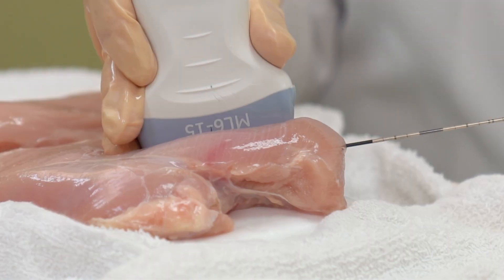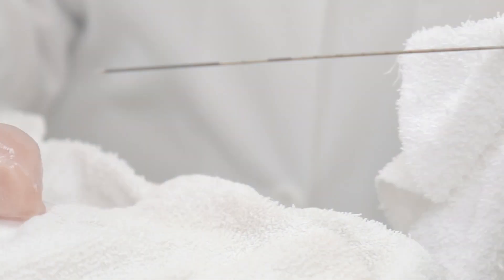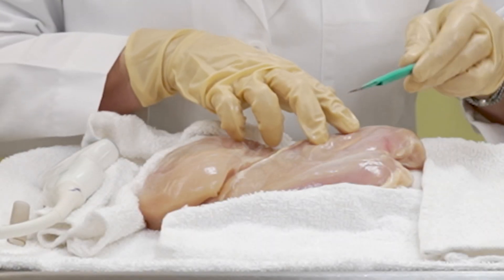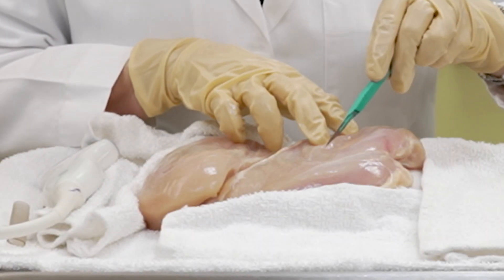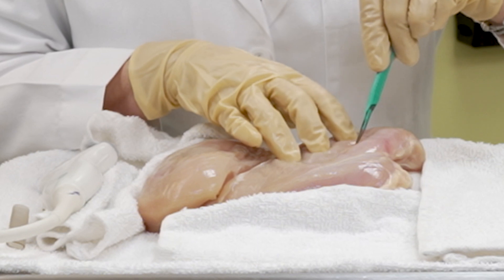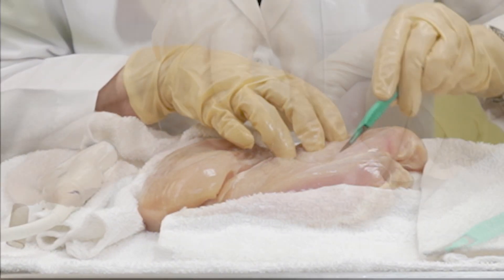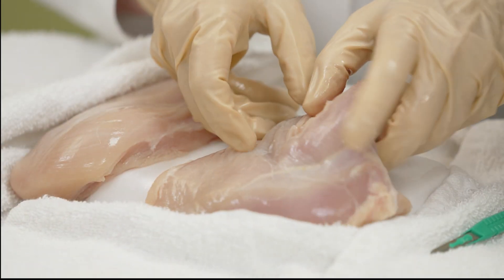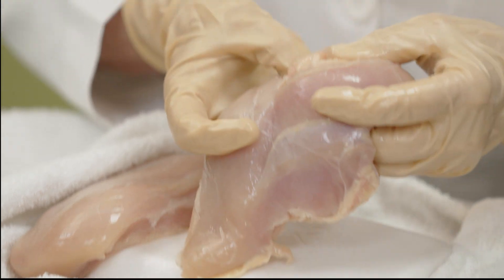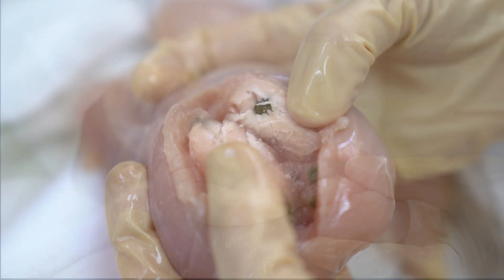At this stage, the physician removes the probe in order to showcase the internal positioning of the ice ball. The physician cuts through the phantom, revealing the ice ball still enclosed within the breast tissue. The targeted area, represented by the caper, is seen surrounded by the ice ball.